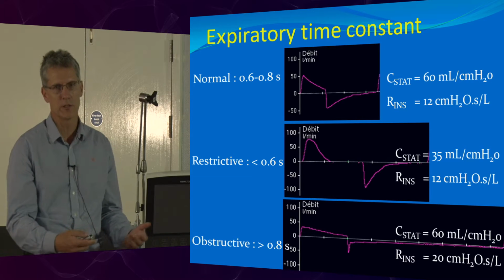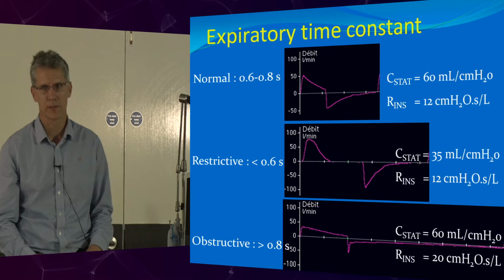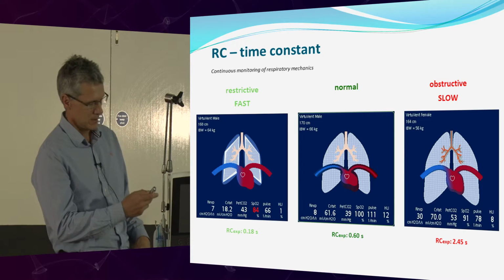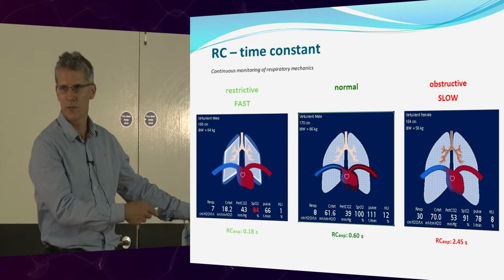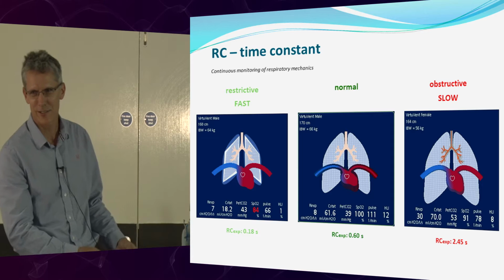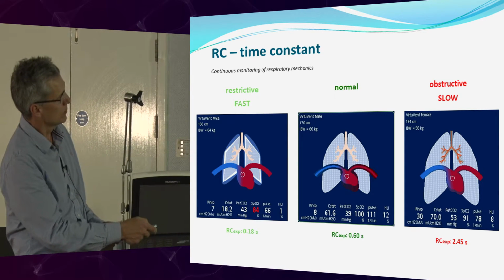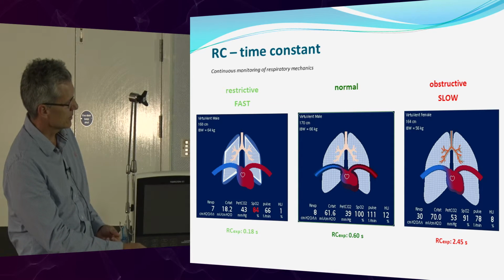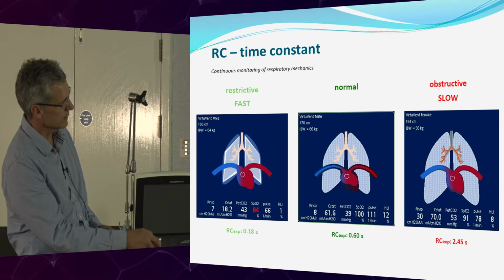With ARDS and pneumonias, the tidal volumes go down, they're quite puffy, aren't they? And here's one of the, who uses this screen? Like the pictures? Again, this is just computerization of stuff. So there's a low time constant here. The time constant's low, the lung shape changes. You get square lungs, yeah?